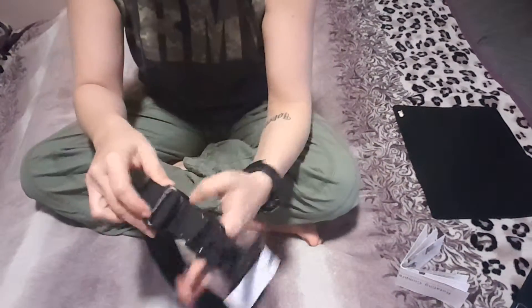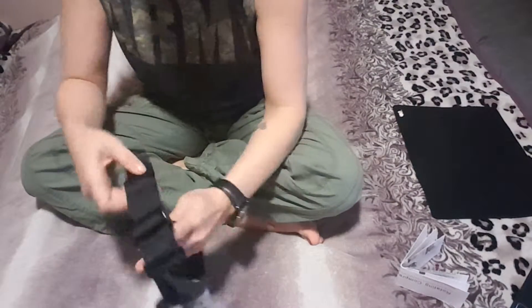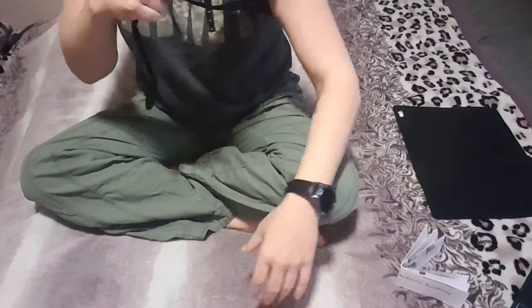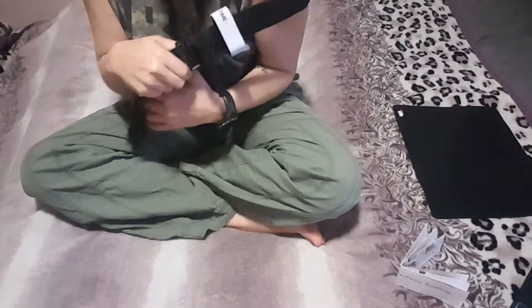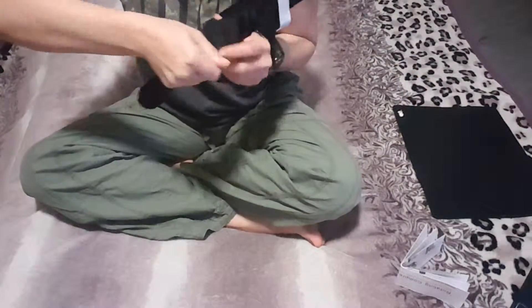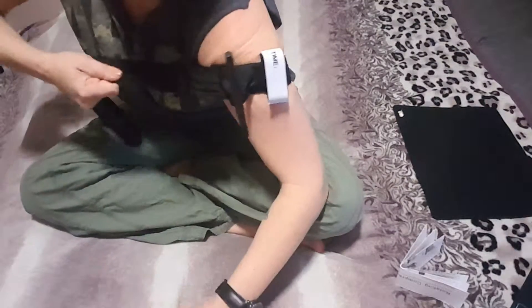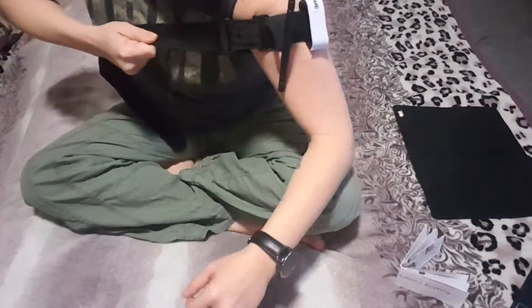You can do the exact same thing with your arm. My arms are tiny, so put it on. If you've got an injury anywhere in your arm, you're not going to hold it out to the side like chicken arm — you just can't because you're going to go straight down. So then you're going to start tightening. There's a better one-handed method with this one which they actually show you, so I'd be keeping my arm down as much as possible. It's just one-handed operation.